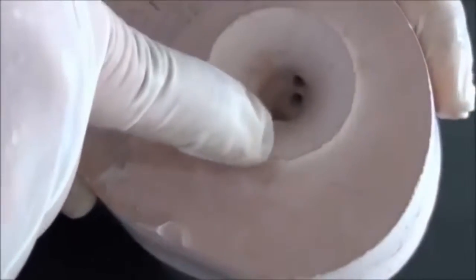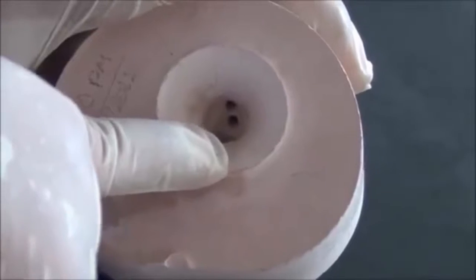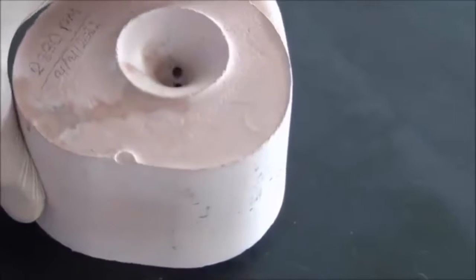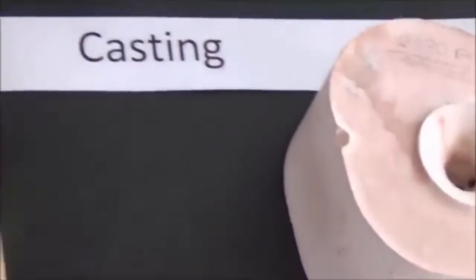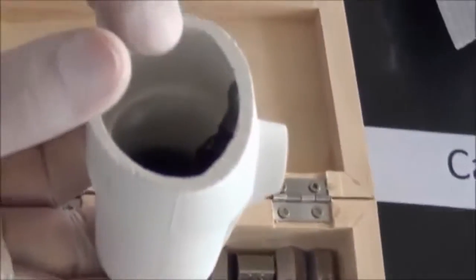These empty tunnels, this part is exactly resembling the funnel. These empty tunnels at the beginning are the exact duplication of the sprues, and later on inside you will have empty spaces where the metal framework wax up was done. Now this is ready to go to the casting machine. There is a place in the casting machine where this is placed and heated. In another part of this casting machine we have the crucible. This will take the metal ingots in.